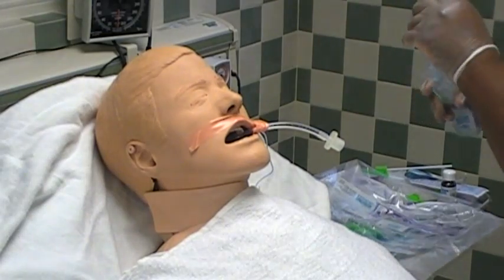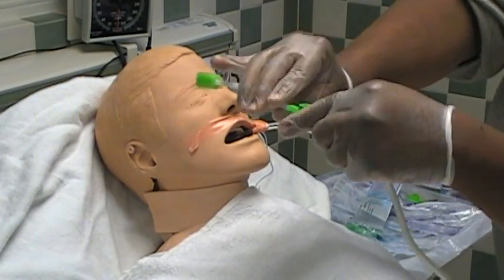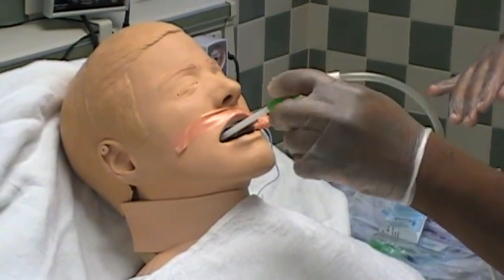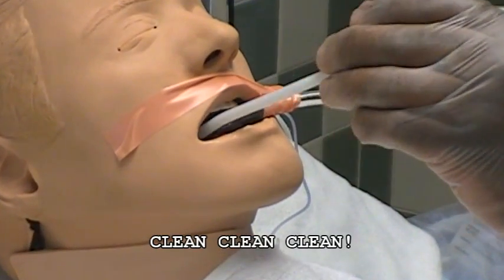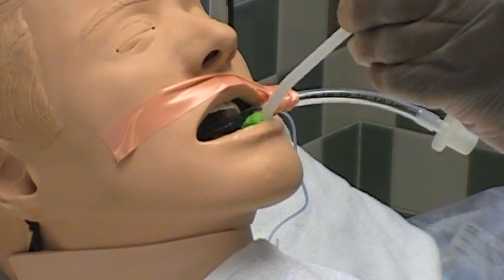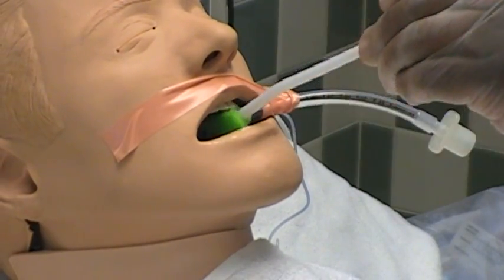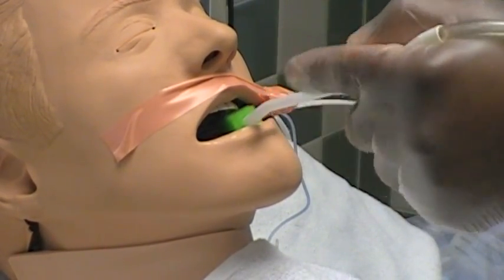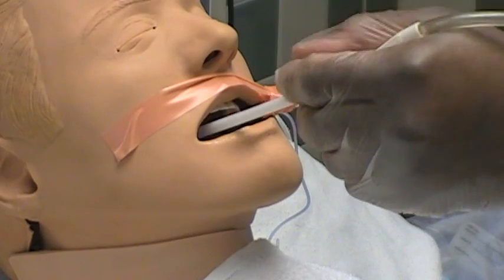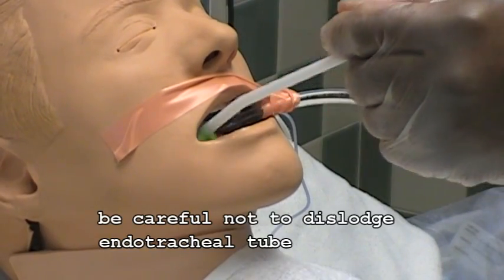He's going to attach the green swab to the suction tubing, and he's going to gently swab the patient's teeth, tongue, and around the endotracheal tube. Get everywhere in the mouth. Place the swab perpendicular to the gum line and turn the swab in a clockwise rotation to remove mucus and debris. Apply a little bit of pressure — just enough to do some good scrubbing. He's going to have his thumb placed over the suction port and apply suction when needed. You can see he's getting everywhere within that patient's mouth, including around the endotracheal tube.